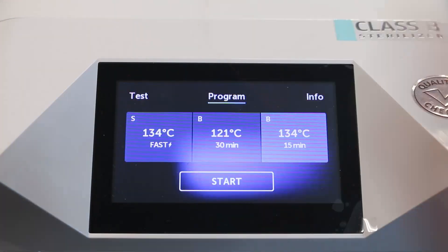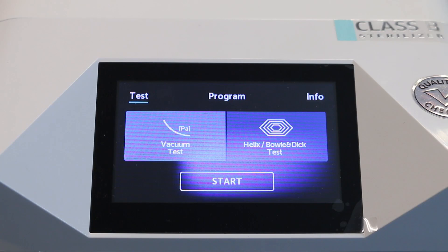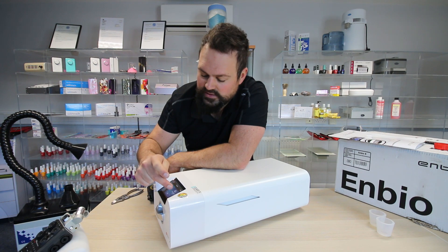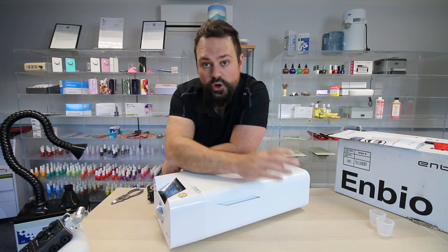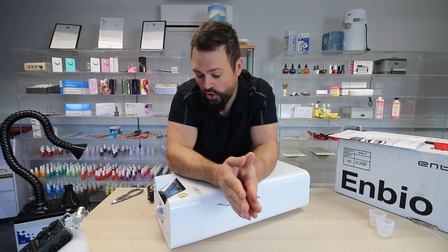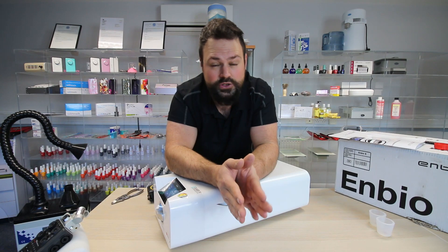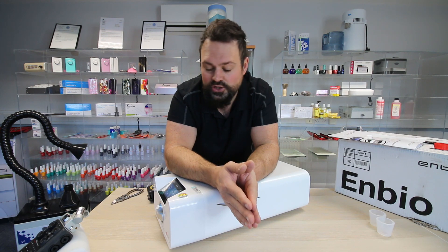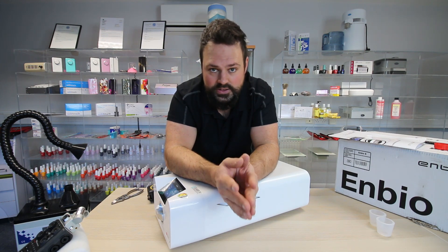First of all though, you need to go to test. There are two tests when you first plug your device in that you need to run. The first is a vacuum test to make sure the seals are working. The next is the helix test, which checks that your instruments are actually being sterilised — that's the most important test. You simply tap on each test and press start. Those tests will be logged on your USB stick, showing that the product was self-validated and doesn't need an engineer to commission the device.